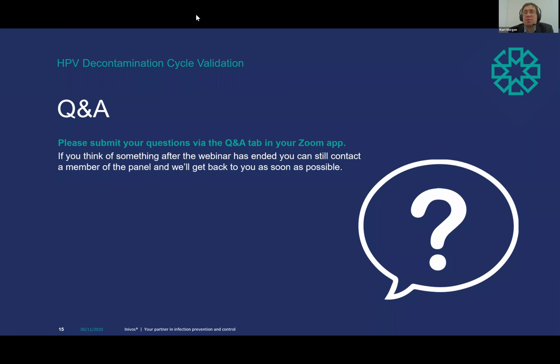In terms of process times, our machine is trying to reach certain humidity thresholds as it's operating. So if surfaces are absorbing the solution that's been injected, it takes a little longer to inject. But we obviously continue injecting until the thresholds are met. And during the cycle, if a room has got lots of absorbent surfaces, the machine may have to re-inject several times to make sure that for the entire dwell period, the thresholds that were tested against the gold standard biological indicators are actually met. So I don't know, Enrico, if you have anything to add to it.